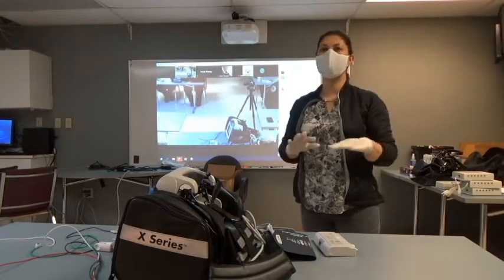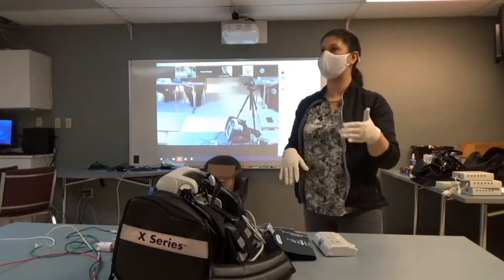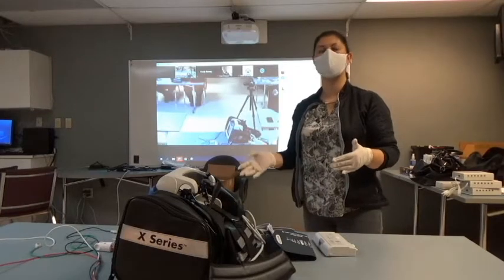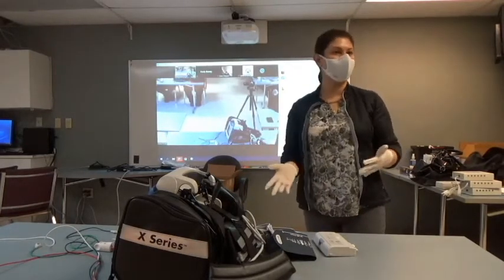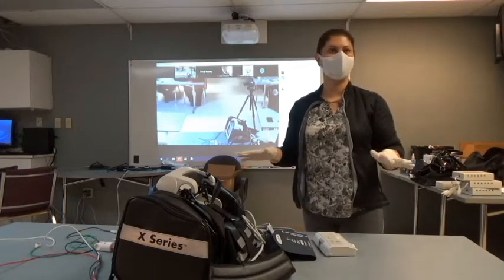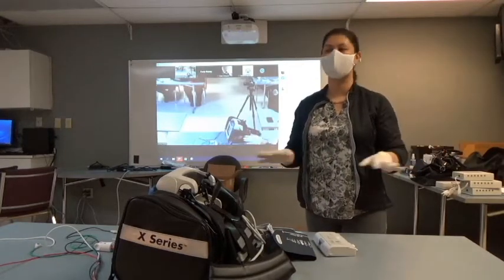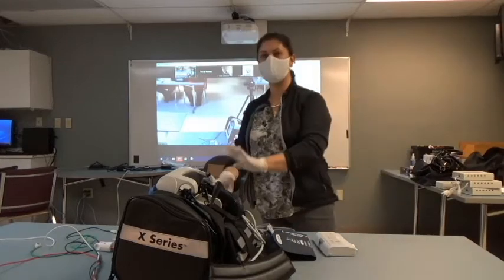There is no ink inside this device. Okay, so there's a right way and a wrong way to hang this paper. There's a picture inside the door. It's just a roll of paper, but if you put it in backwards and you don't follow the picture, it's not going to print because this is a thermal print, okay? No ink in the device. So if you go, man, send this thing back to Boston, it's not working, it's out of ink, it's because your paper's in backwards. Any questions about that?